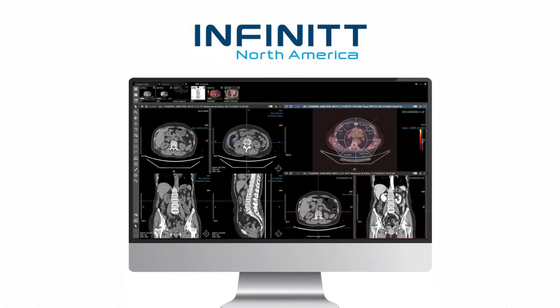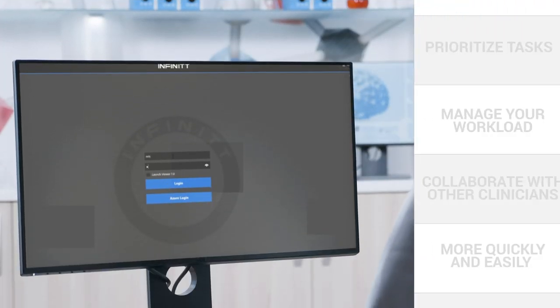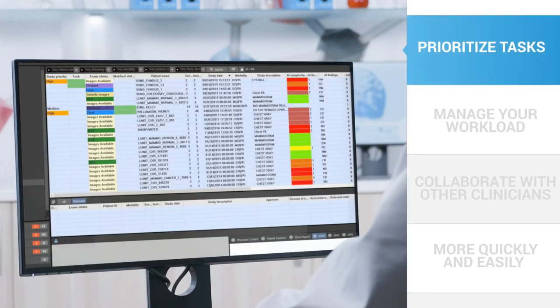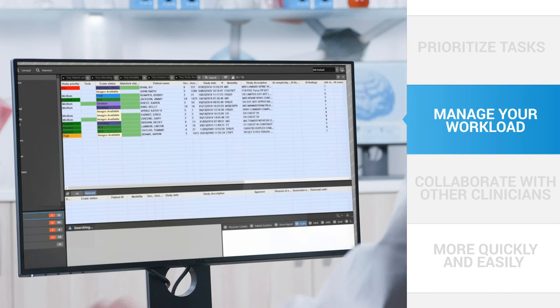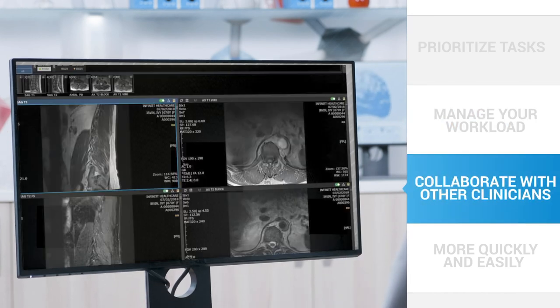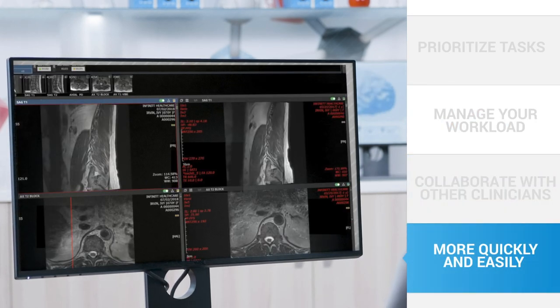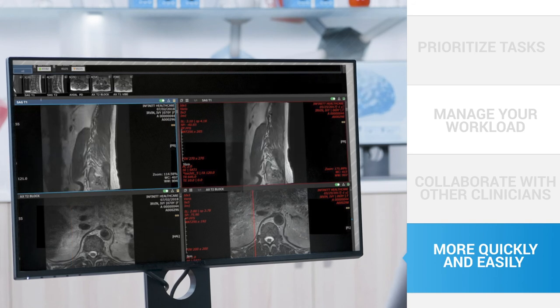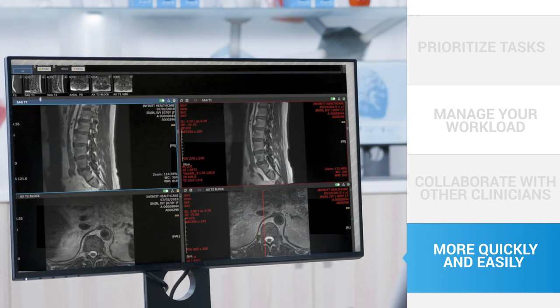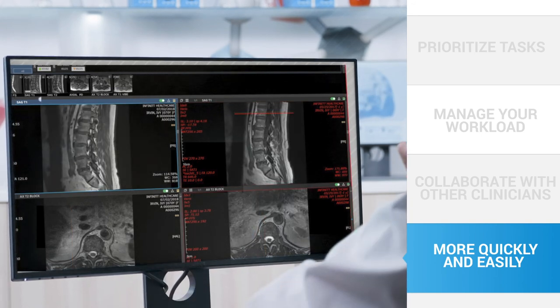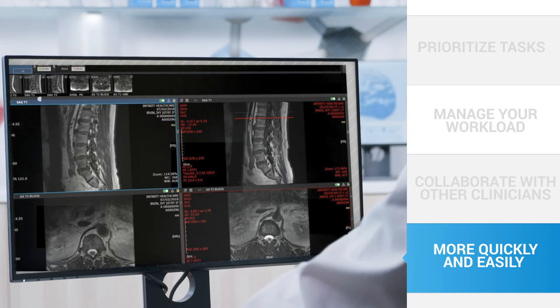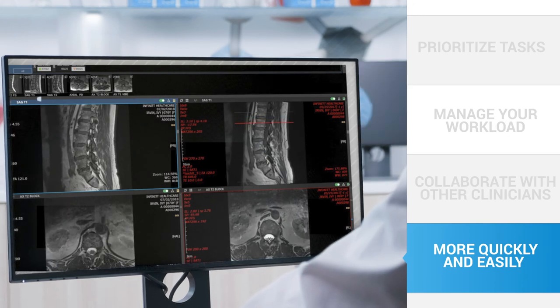Infinite's new PACs version 7.0 is the culmination of these efforts. New functionality in this version will help you prioritize tasks, manage your workload, and collaborate with other clinicians more quickly and easily than ever before. You'll notice the difference with fewer mouse clicks, faster accessing and processing speeds, and greater productivity.